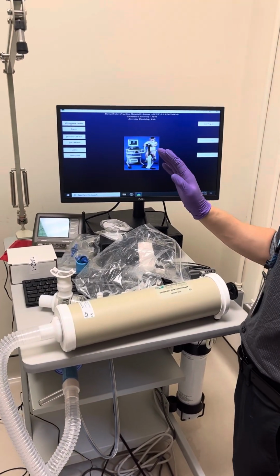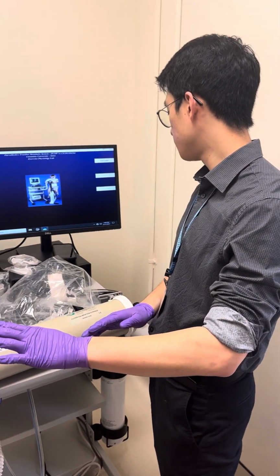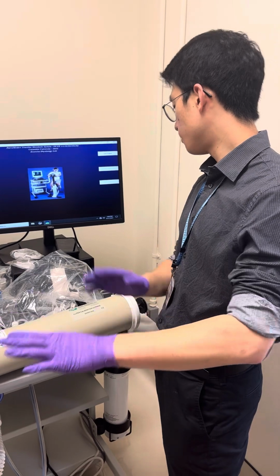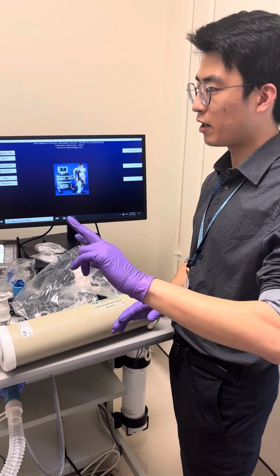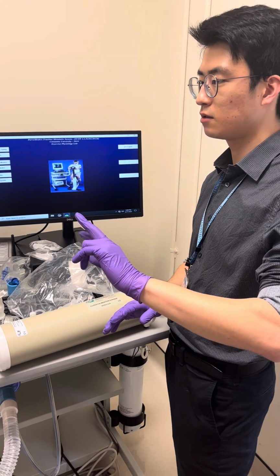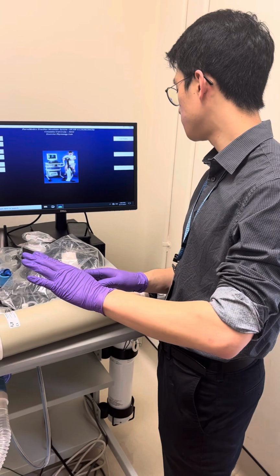Okay. So make sure you explain the test to the person before you actually do anything. Are you guys gonna measure height and weight? We've done that, yeah, in the morning. Height and weight have been done already, so make sure you have that information.